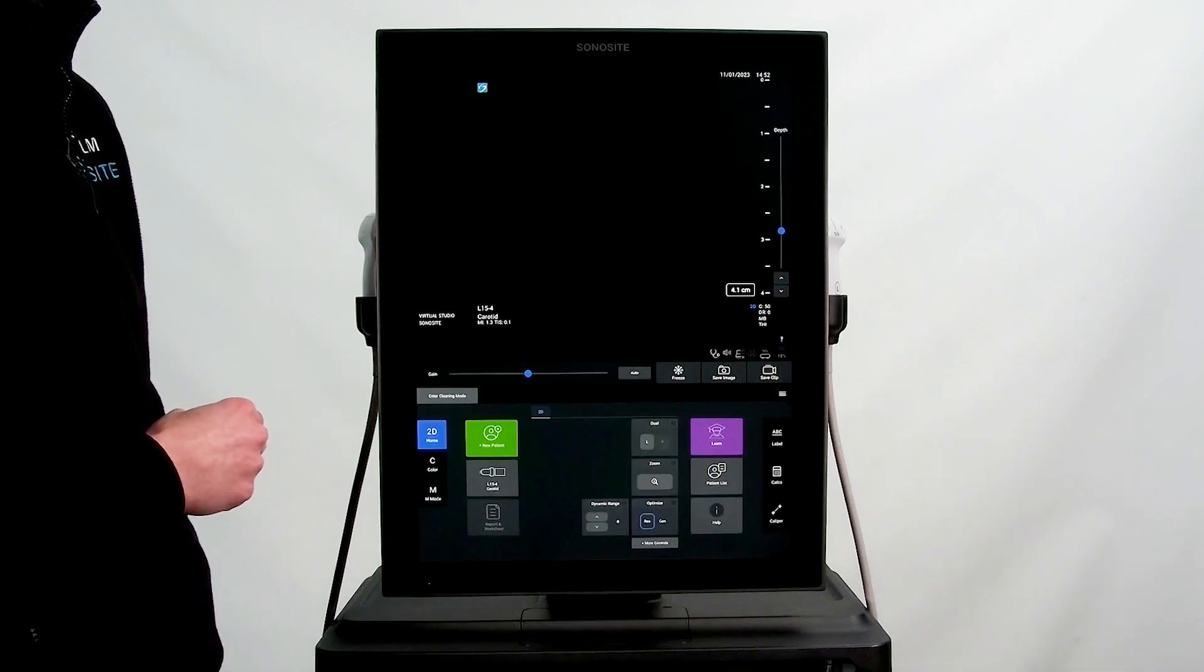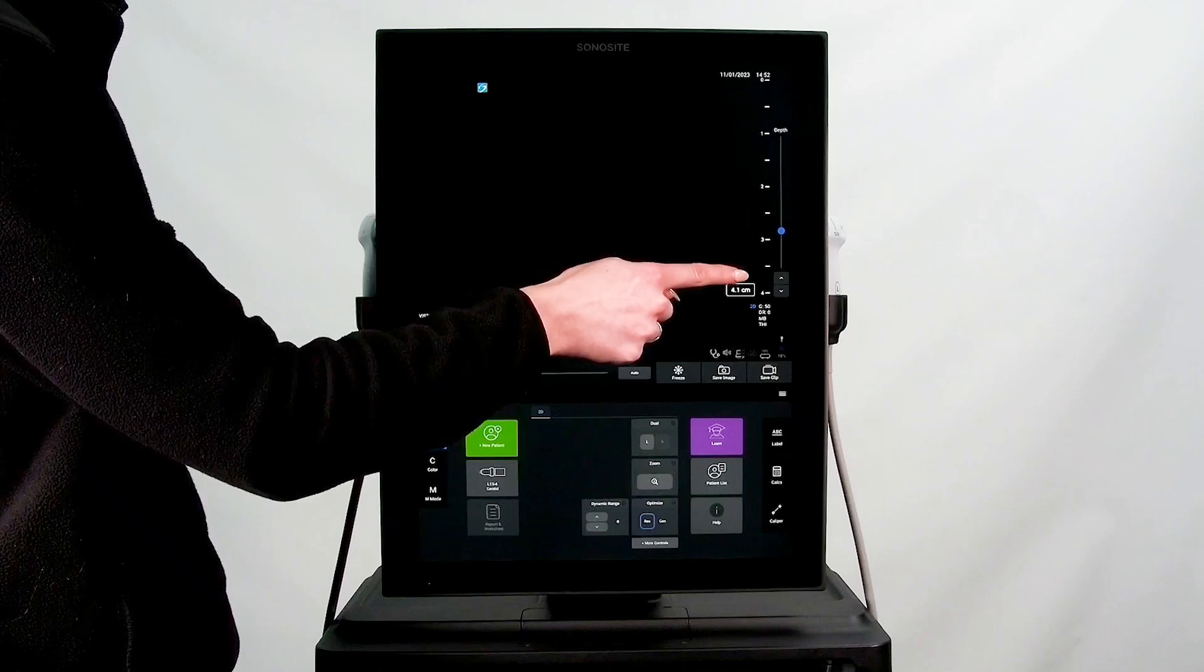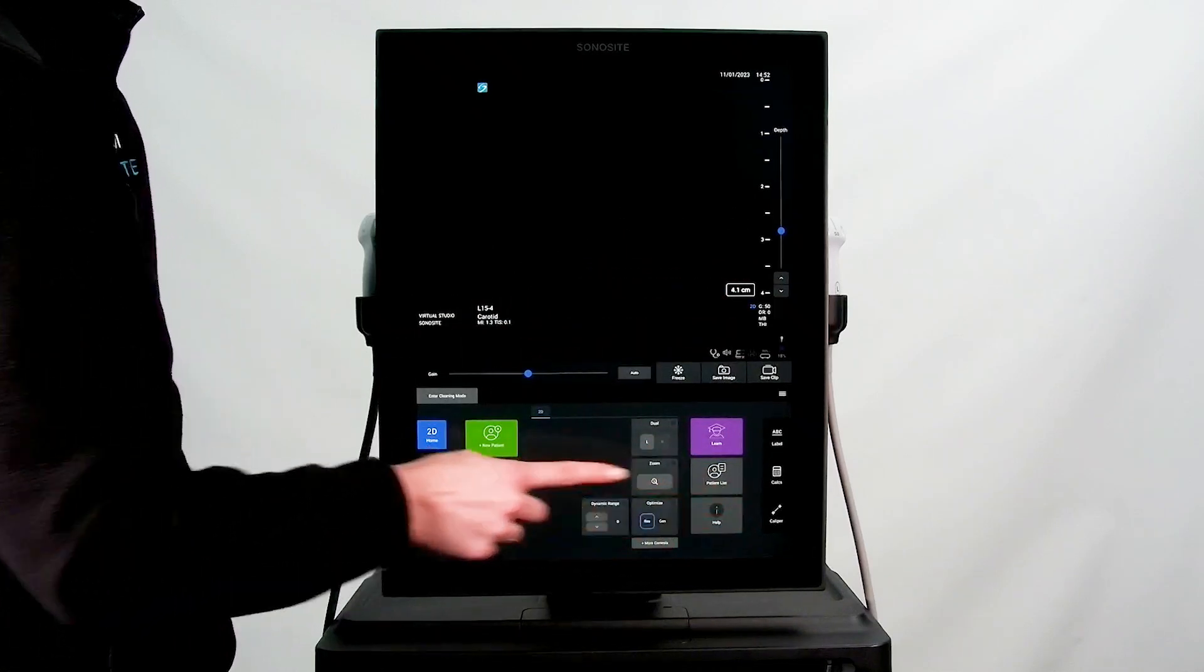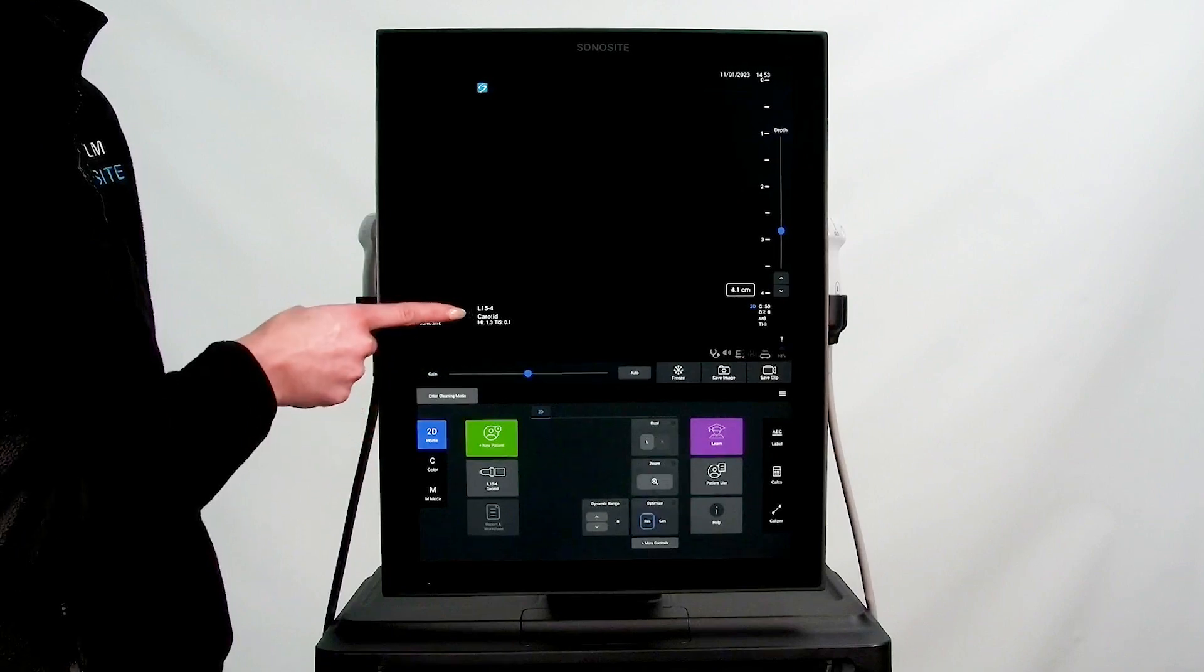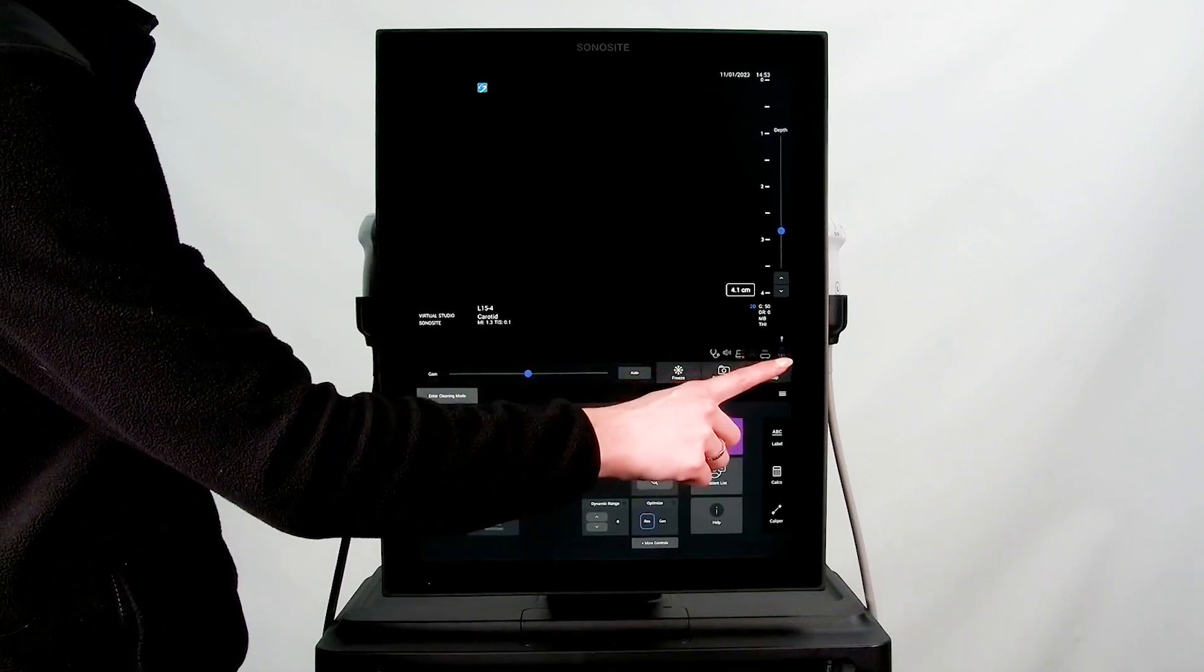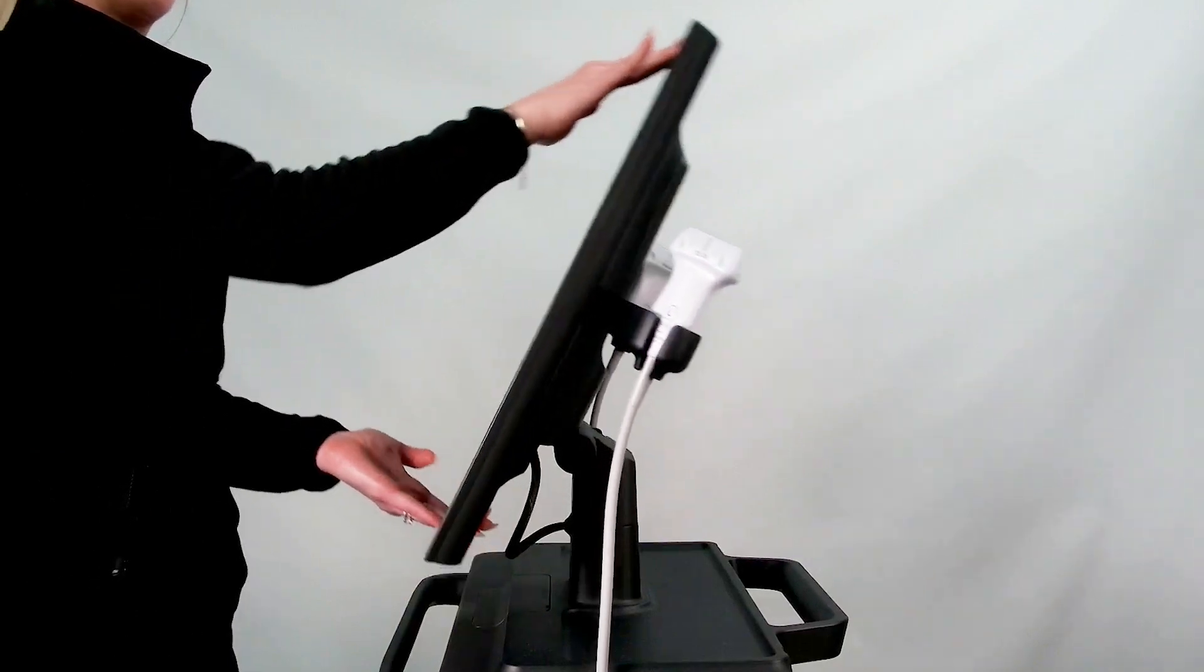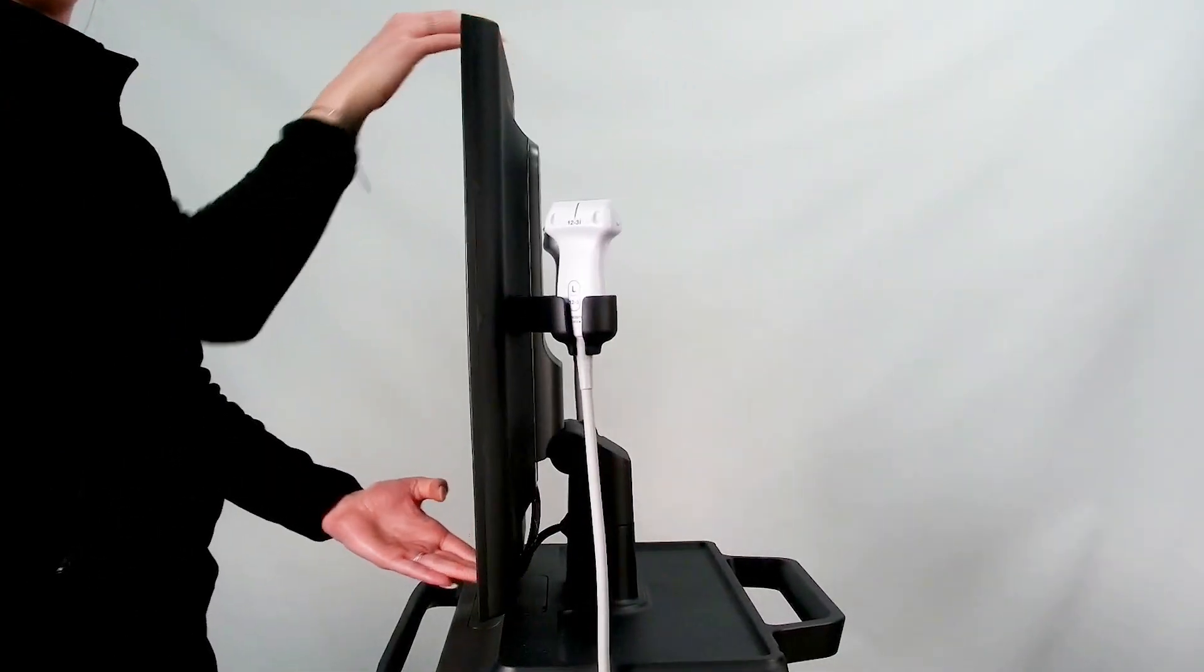The clinical monitor also displays your image and depth markers, calculations and measurements, patient and clinician information, as well as study details and system status icons. The monitor can tilt in order to easily move the system around in tight quarters.